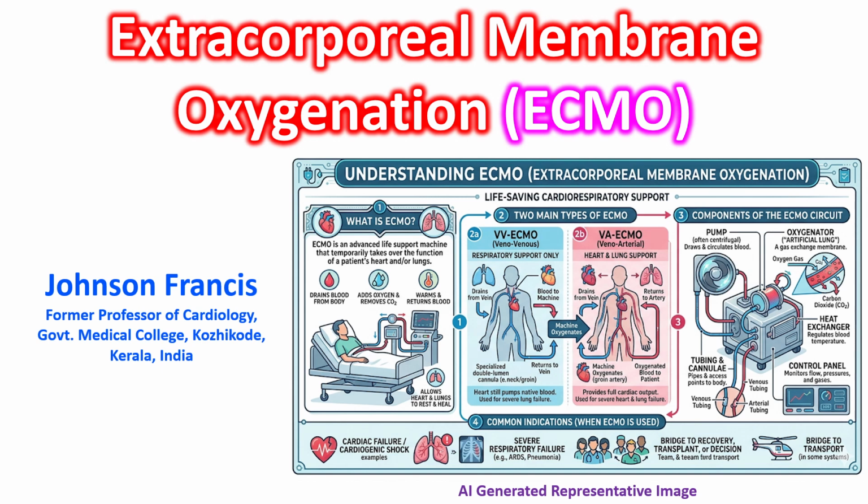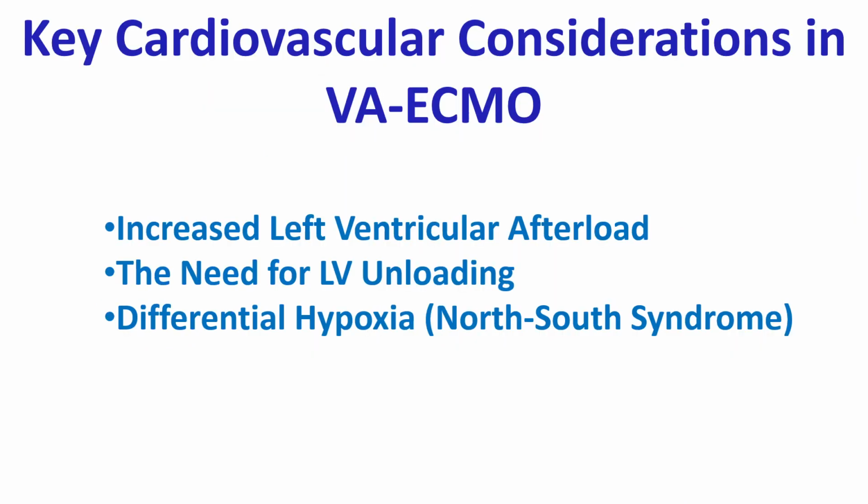Extracorporeal membrane oxygenation (ECMO) is a critical complex intervention in the management of refractory cardiogenic shock and severe respiratory failure. Unlike VV-ECMO, which primarily provides respiratory support, veno-arterial ECMO provides complete cardiopulmonary bypass. This fundamentally alters the patient's native hemodynamics.